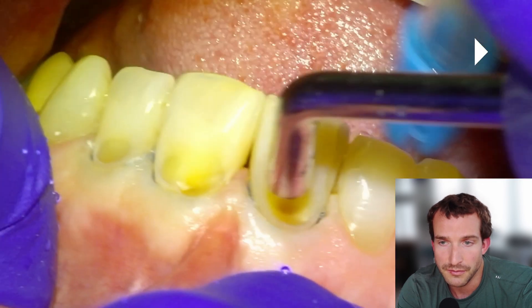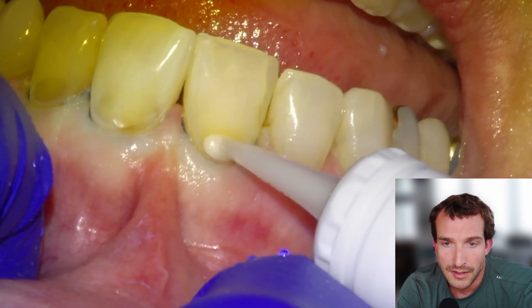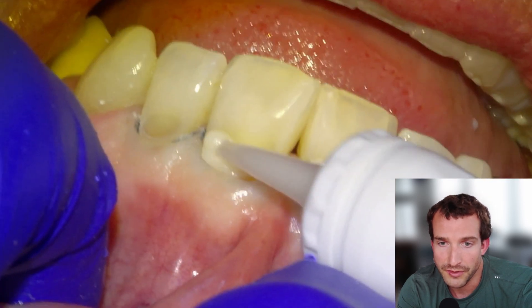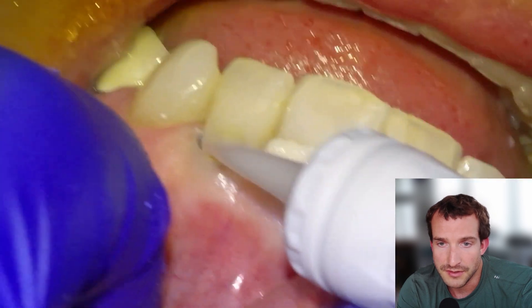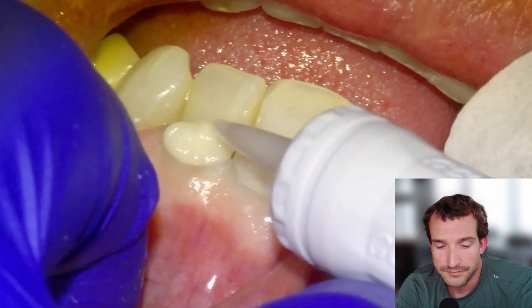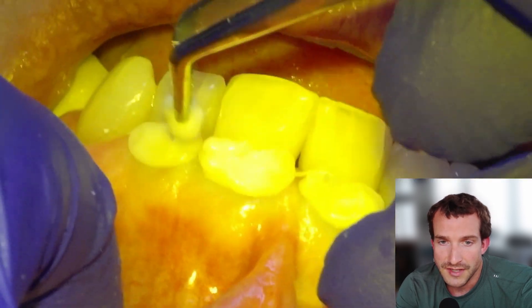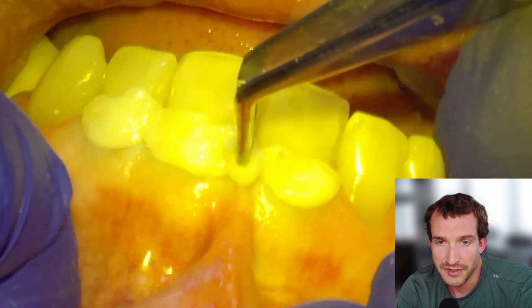We'll dry it quite thoroughly as well — this is the level of dryness I'll leave it at. Then we'll apply the material, overfilling intentionally, and pack it in with a moist cotton pellet to ensure it is well adapted to all of the margins. So we'll just adapt it here — there's a lot of excess.